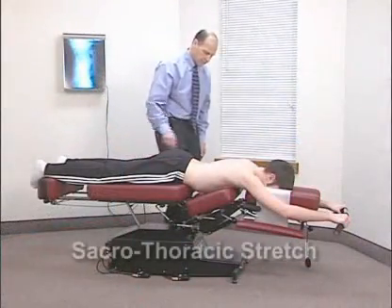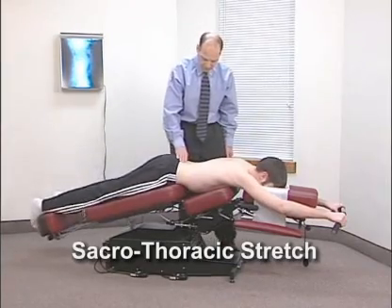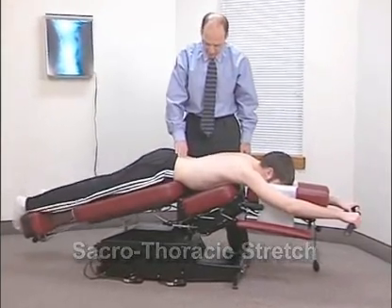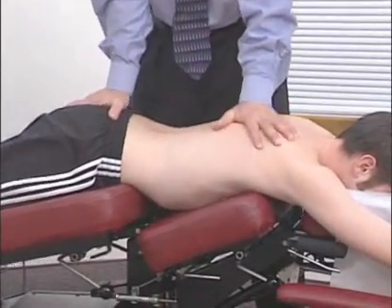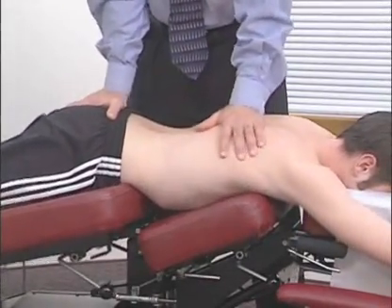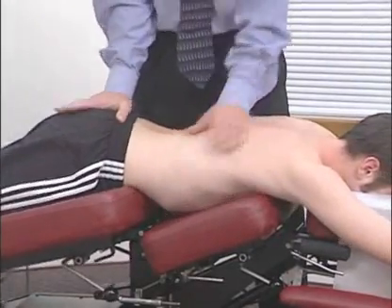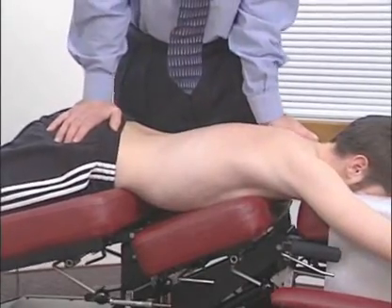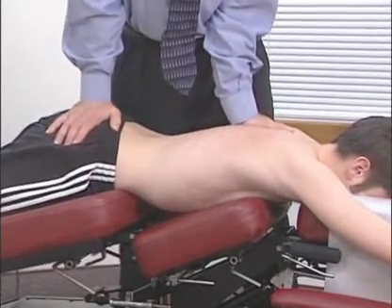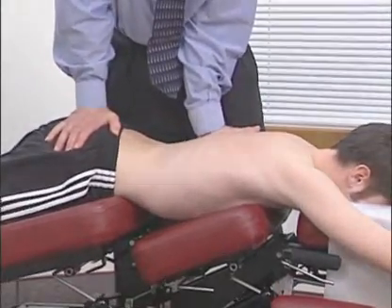The sacrothoracic stretch is applied by placing the inferior palm-hand contact on the sacral apex. The superior palm hand is on the upper thoracic spine, 2 inches outward, away from the spinous process. With elbows locked, apply equal and gradual pressure with both hands as the table descends. Move the superior hand down 1 or 2 spinal segments and apply pressure as the table descends. Work your way down one side of the spine, then the other.